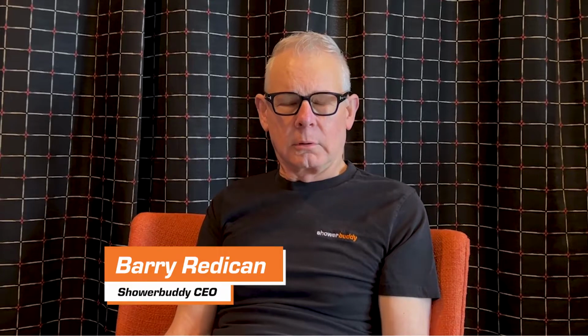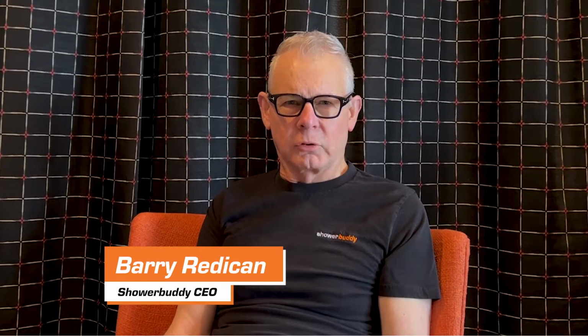This video is about BathCheck and how to use it. BathCheck is a measuring tool and app to allow therapists and homeowners to check their bathroom to see if Showerbuddy can provide a solution to fit in their particular room.